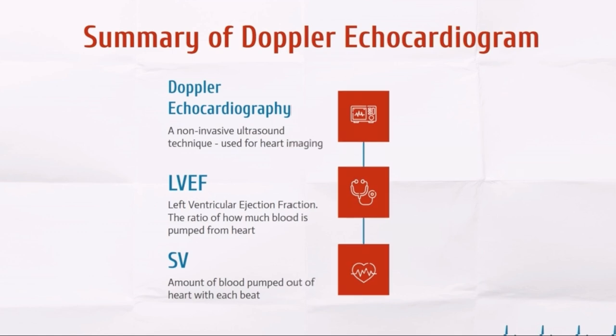Through the use of stroke volume and left ventricle ejection fraction, this can be refined. The left ventricle ejection fraction is a fractional measure of the amount of oxygenated blood that pumps out of the left ventricle into the body. This measurement is used to see if the left ventricle is dysfunctioning. The higher the fraction number, the healthier the heart. For example, a healthy heart has an ejection fraction of 50 to 70%, which means that with every heartbeat, 50 to 70% of the blood from the heart is pumped into the body.